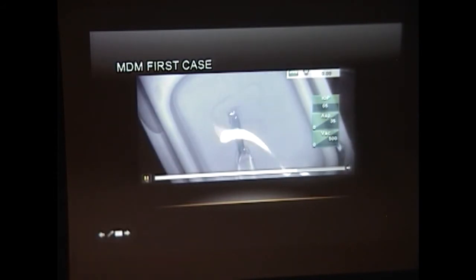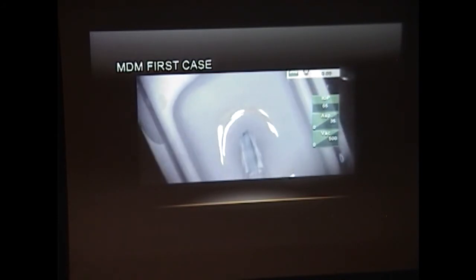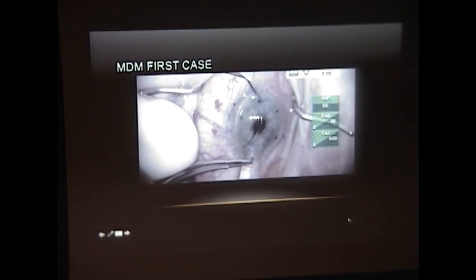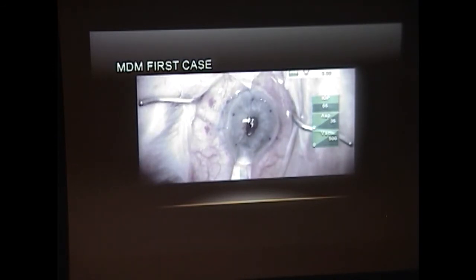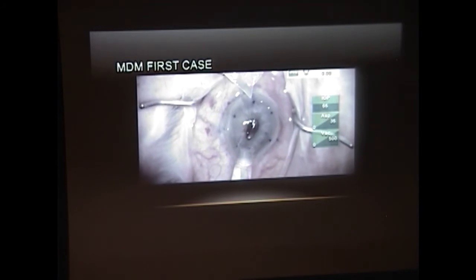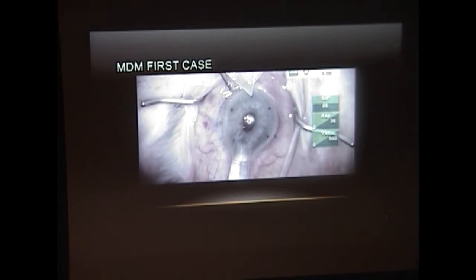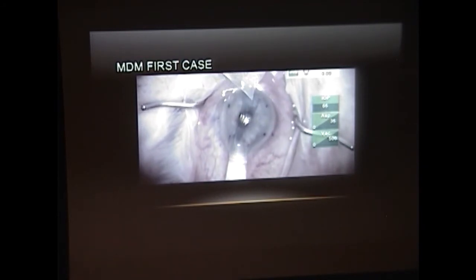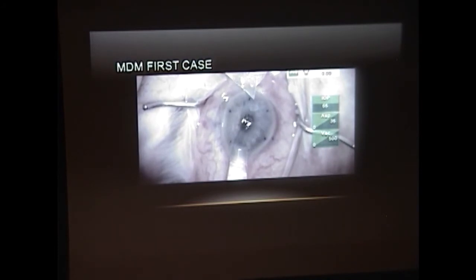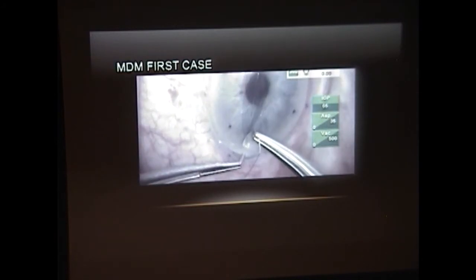But fourth time's a charm. And we've got the bevel turned kind of sideways. Nice deep chamber, but still not a soft eye though. And we inject and it goes right in. And actually, to our delight, it ends up perfectly centered and half unrolled. So now we don't have that much more work to do.